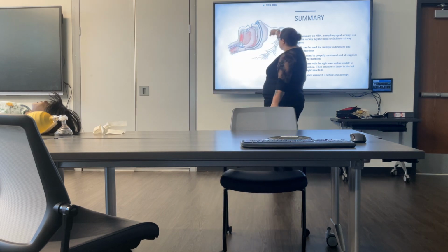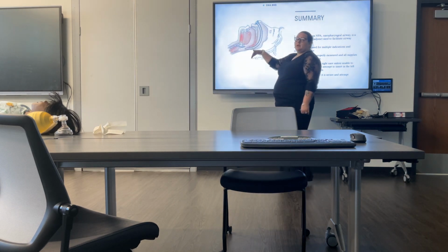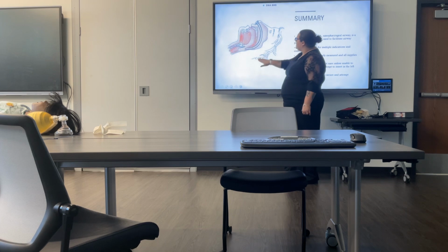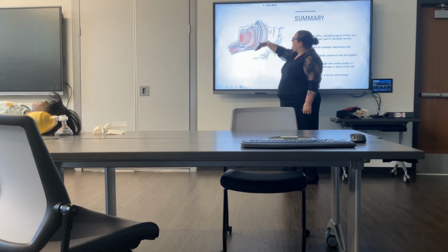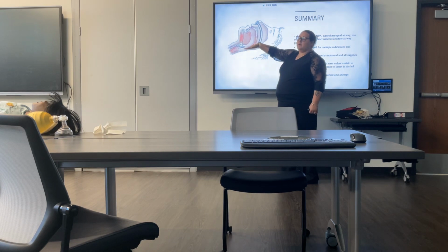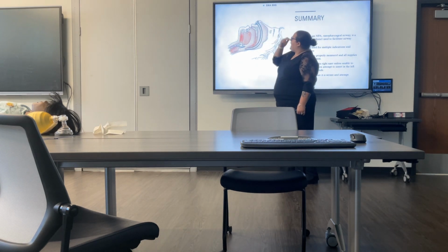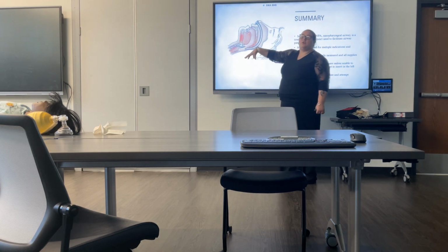So now you can see why your measurement here to here is actually so important through the nasopharynx and its length. Where you measure it from the tip of the nose to the earlobe, you can actually see how it is able to be equivalent to your nasopharynx here. And you can get it all the way to the hub at the nostril, and then the actual whole trumpet, that hollow tube, is here, and this is what you're actually delivering your air through.